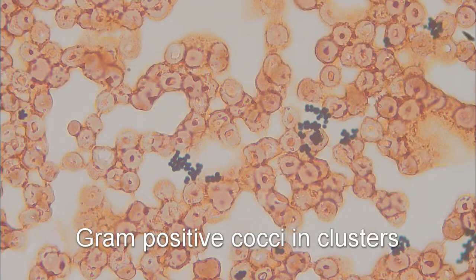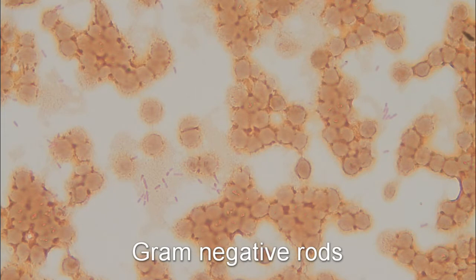And so when you do your gram stain, you just read that, and normally you'll see something like gram-positive cocci in clusters. You can also see gram-positive cocci in pairs or chains. You can also see gram-positive coccobacilli, or your gram-negatives would be mainly gram-negative rod. That's the main one you get. And you can also see gram-negative cocci in clusters, which would be your Veillonella, which would be in your anaerobic bottle exclusively.